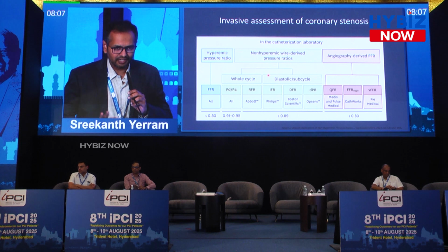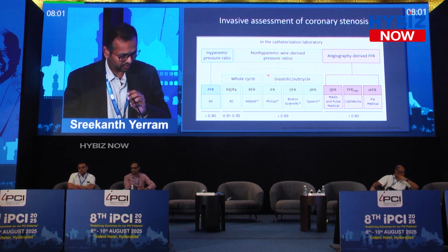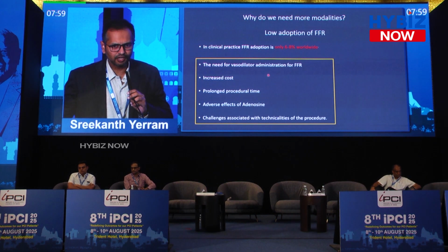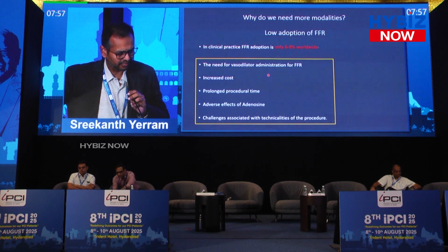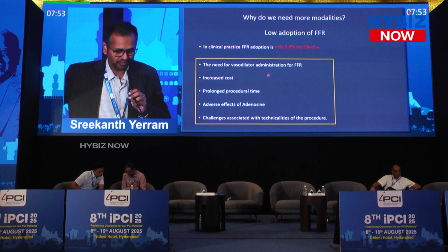If you look at that, I usually use FFR or RFR. Most of us would be using these two modalities which we are familiar with. Let us look into those modalities in detail. So the world over, the FFR adoption rate is less. It is because of many reasons.